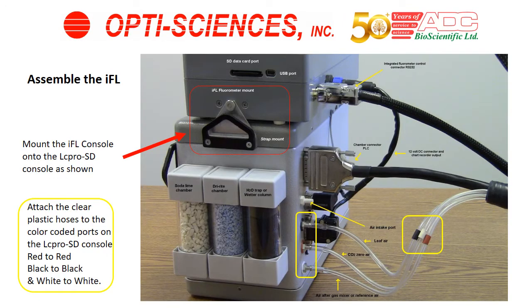Assembly. After you remove the components from the box, you'll see the LC-PRO SD console, and on the top of it, you may either have the mounting brackets for the IFL shown in the red square, or they may be separate and may need to be mounted onto the LC-PRO SD.